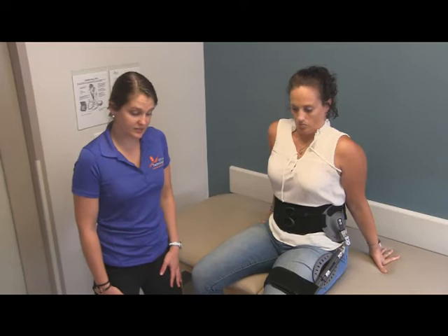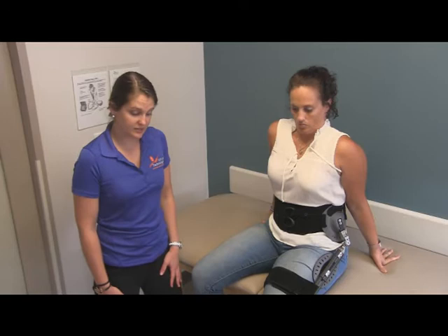It is meant to keep your hip out to the side and often times to keep it in a slightly flexed position as well. And that is how you fit a hip abduction brace.